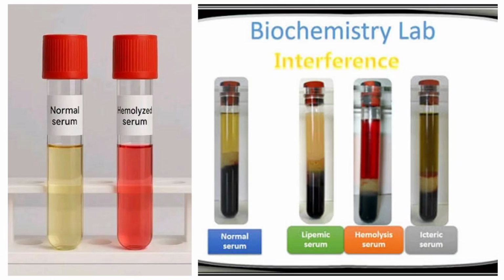So if I compare these two, if this hemolyzed sample gives me an outside linearity result, in fact, even if it doesn't, let us assume that the hemolyzed sample is still giving me a result within linearity, I can't trust it. Why? Because the hemolysis would have interfered on the result I'm already getting. Maybe I should explain it this way.